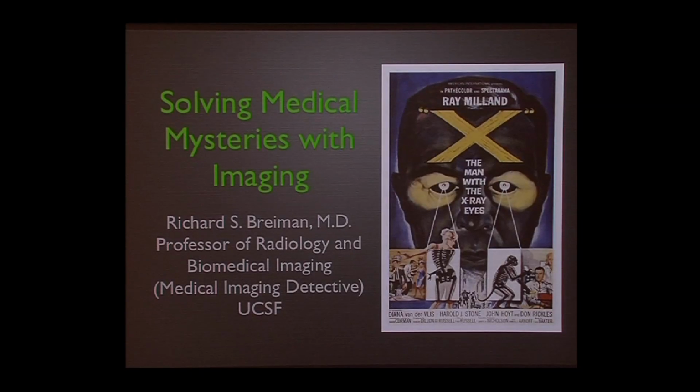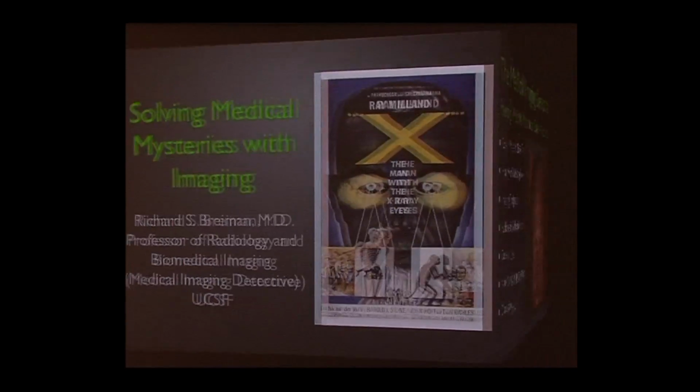Thank you, Jeff. Well, I hope we have some fun and you learn something with this. We really are medical detectives. We have these great tools. Much like Sherlock, we have a real bag of tools, which we'll go over many of them, but in the space of this time constraint, we can't go over them all, but everything we do is detective work. Even normal exams, we're looking for some answer, and that is an answer when it turns out to be normal.